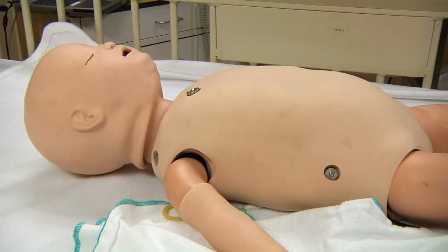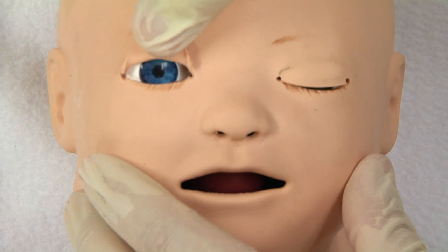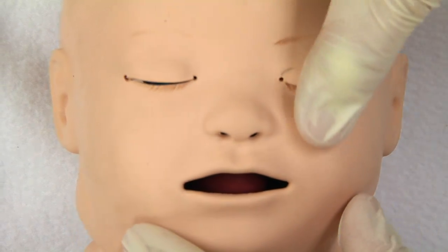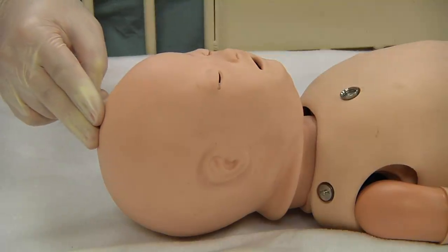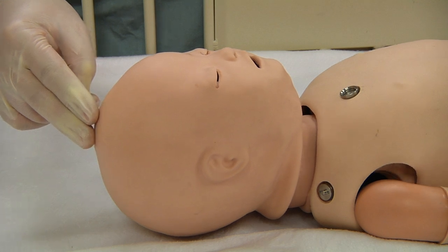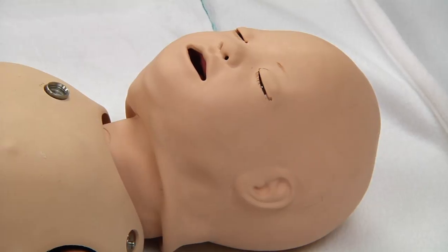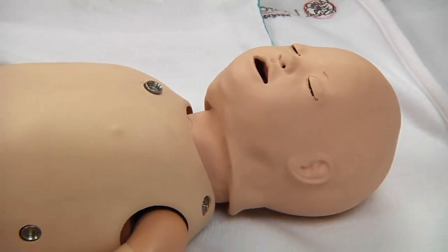Several clinical signs will also aid in the assessment of SimBaby. The simulator may present with torso motion and has interchangeable pupils that may be normal, constricted, or dilated. A distended fontanelle can be palpated in simulations, indicating elevated intracranial pressure. This concludes the video orientation for the SimBaby Patient Simulator.